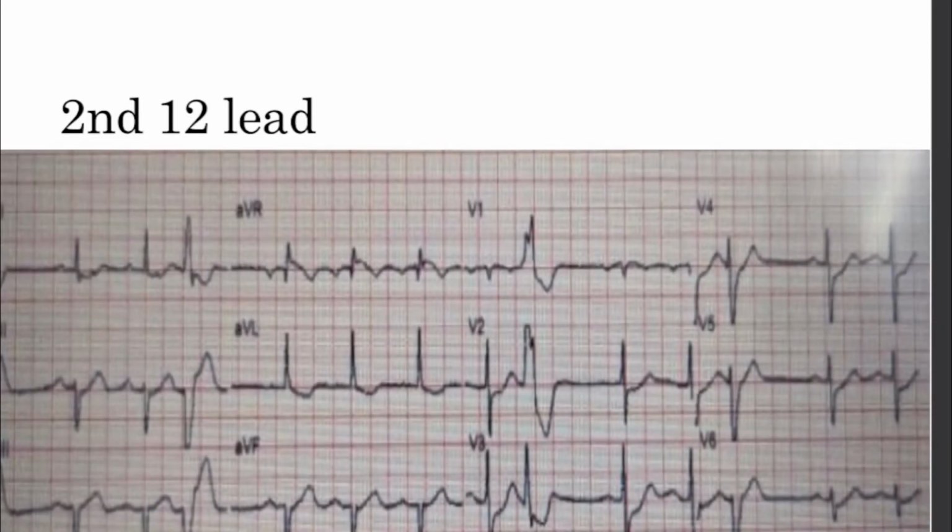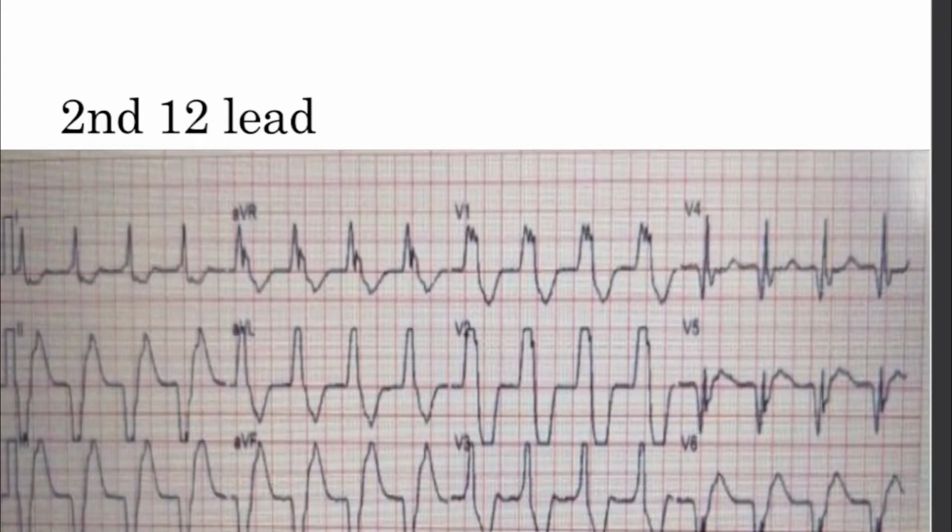Second 12 lead is this, and you're fairly close to the hospital, so you might as well just give a little heads up, so you want to transmit this 12 lead. And while you're transmitting this, you notice that the patient goes into a weird rhythm, and you happen to get another 12 lead of that. Now, what's your next step?